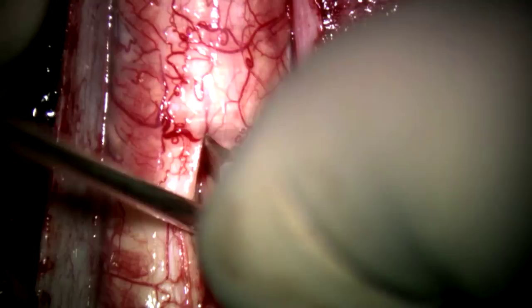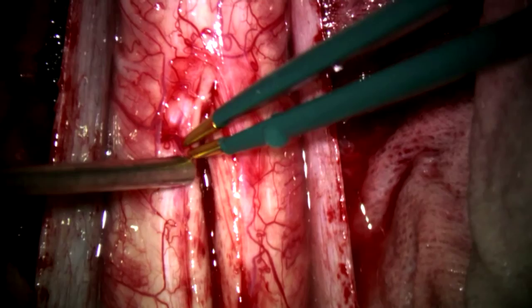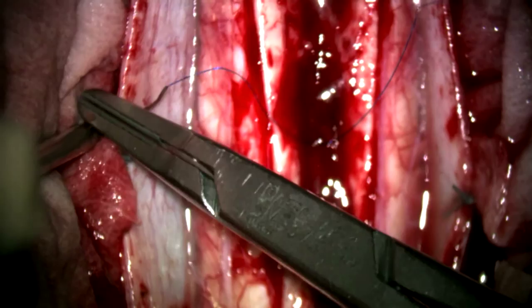Myelotomy was done by sharp dissection in order to expose the tumor from all of its borders. The bipolar was used with a very low current and as minimal as possible. Then, in order to open the cord and to expose the tumor, we just put a suture from the dura to the pia on both sides.